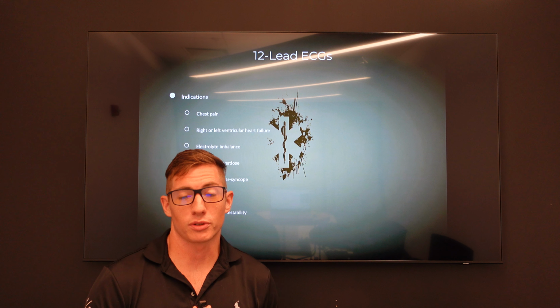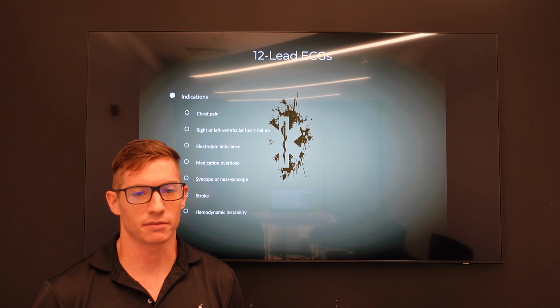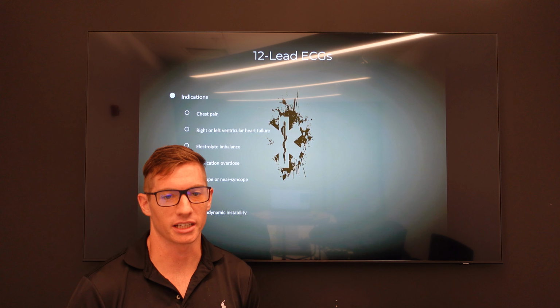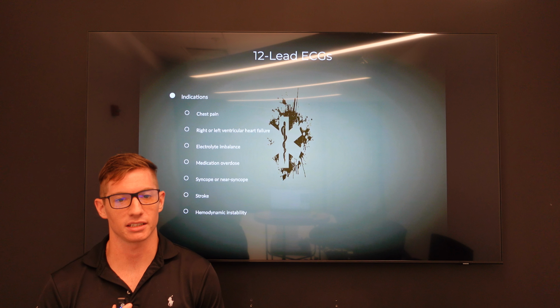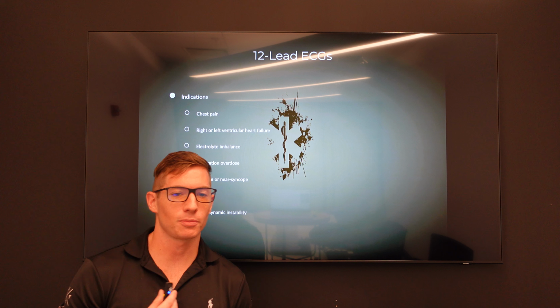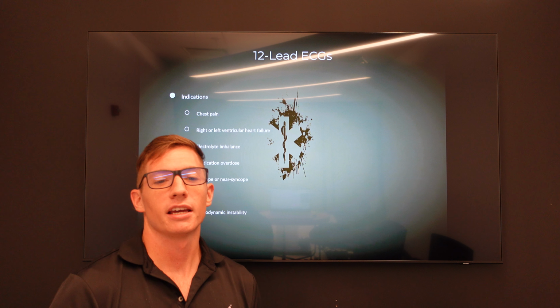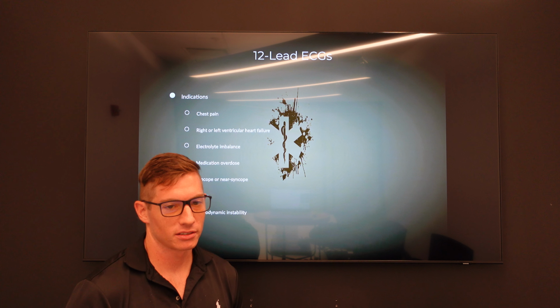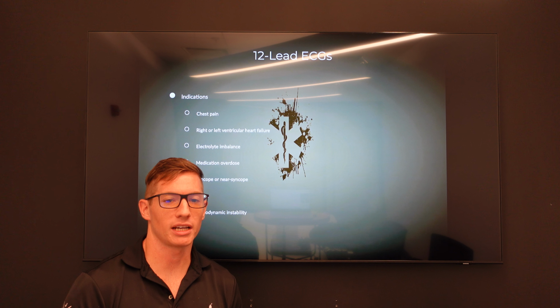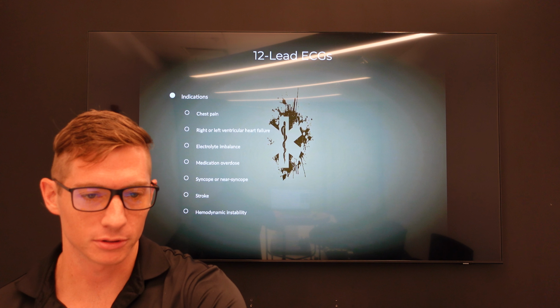All right, so indications: we have chest pain, discomfort, electrical injury, known or suspected electrolyte imbalances, known or suspected overdoses, RVF, LVF, stroke, syncope, near syncope, hemodynamic instability of unknown etiology. I just read all this. Device capable, yes.